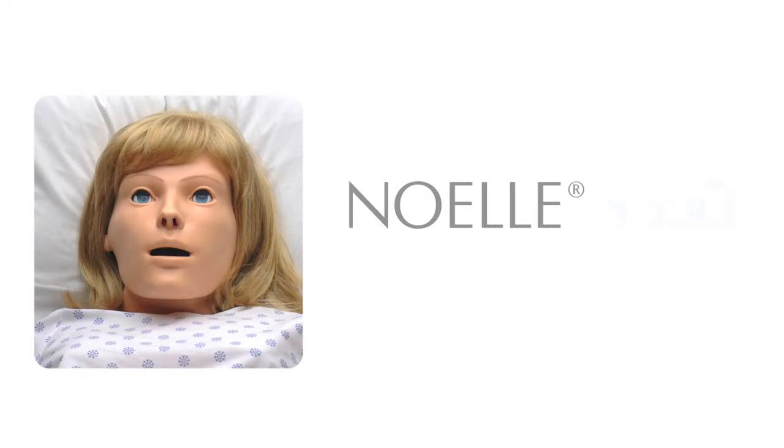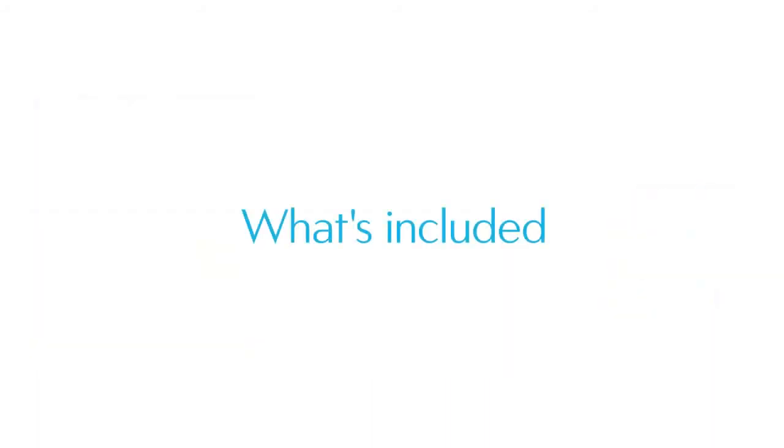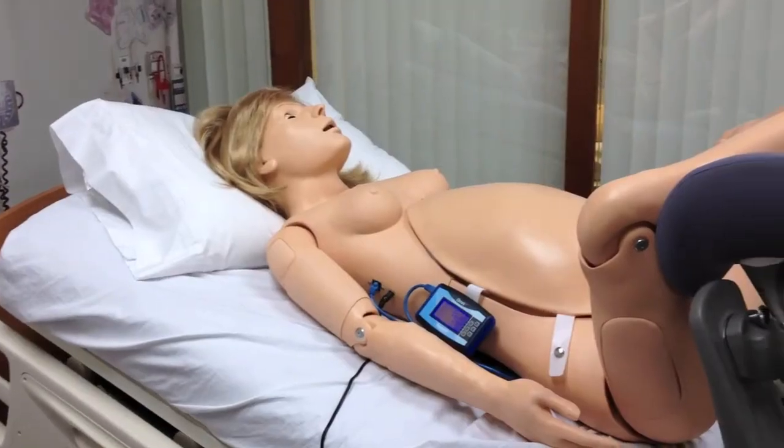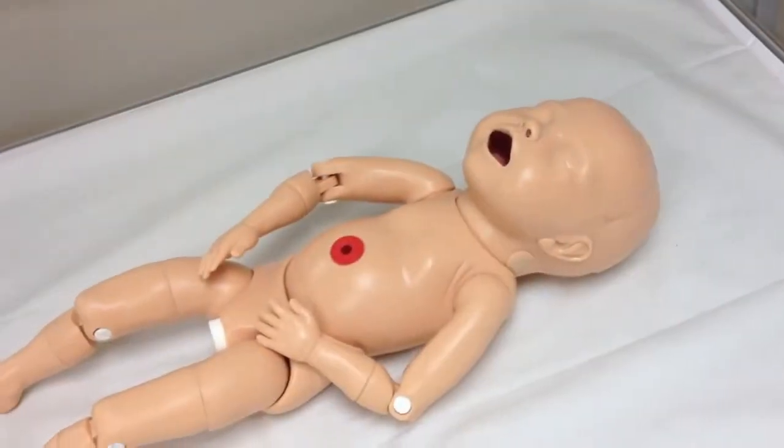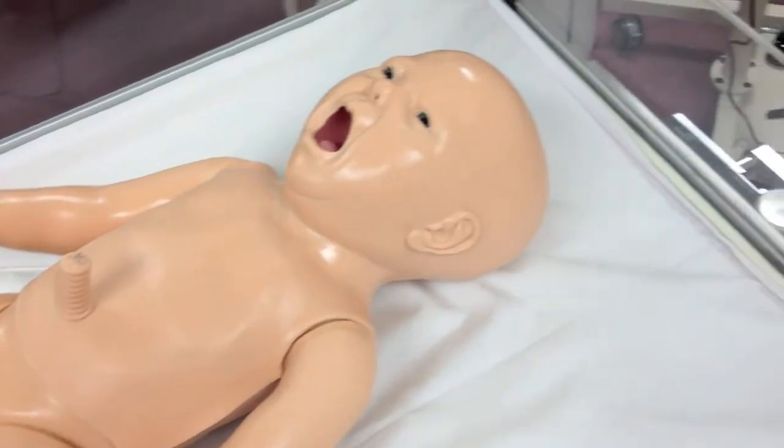This video describes the NOEL 550 and 551. For much more detail, please consult the instruction manual. The NOEL 550 includes the mom, the fetus, and the newborn. The NOEL 551 is just the mom and the fetus.